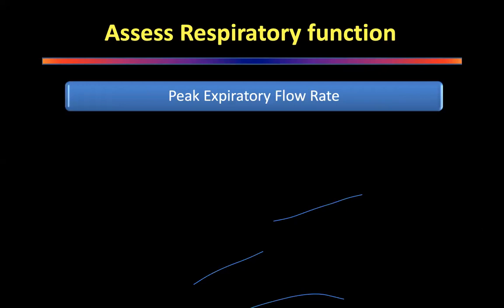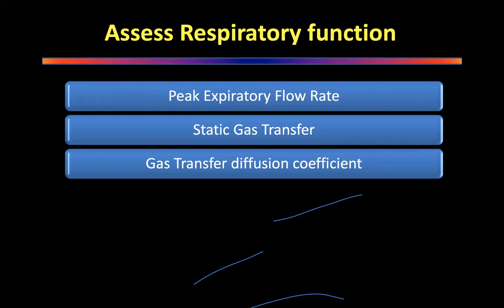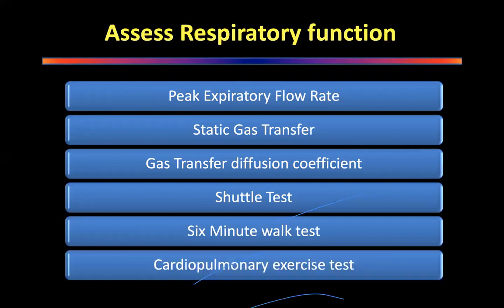When you assess respiratory function, some of the other factors are peak expiratory flow rate, you'll measure static gas transfer, you'll measure gas transfer diffusion coefficient, shuttle test, 6-minute walk test, cardiopulmonary exercise test. So we're going to go through each of this in great detail.